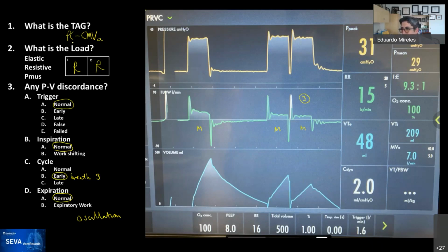Rob, any comments about the tag? Well, looks good. All righty. So we all agree with you on this one, Samir. So happy face. All right.